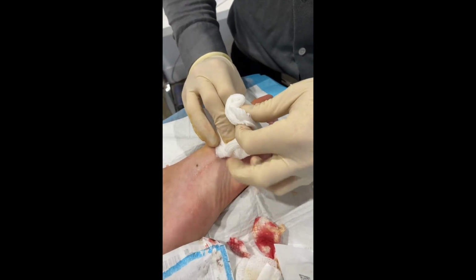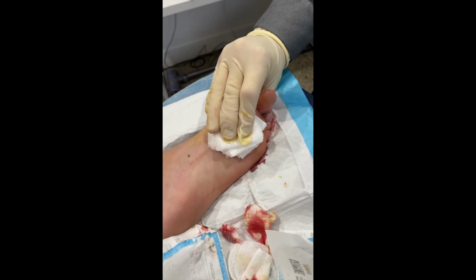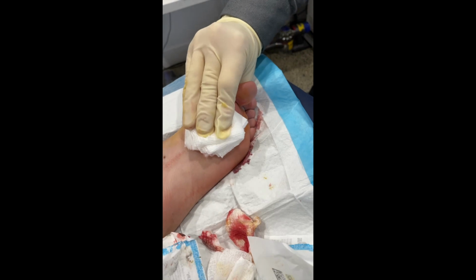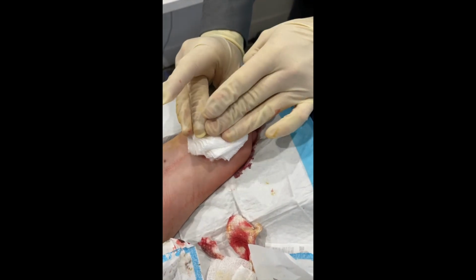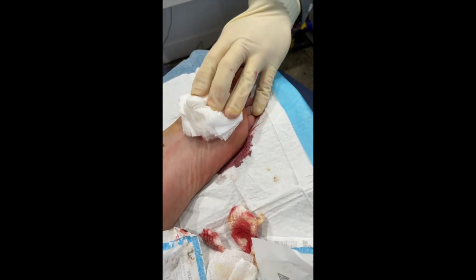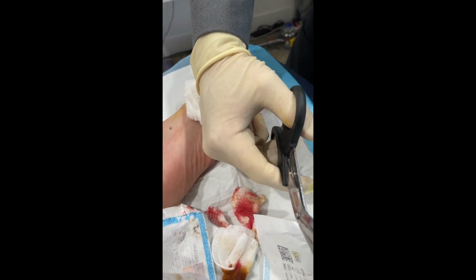As you can see with this, I do tend to like to use lots of dressing just for the bleeding. We're using sterile melolin followed by sterile gauze just to go over the top of that. And then I like to use sports tape to lock it off, just because sports tape tends to be a little bit more secure than other tapes when doing this.